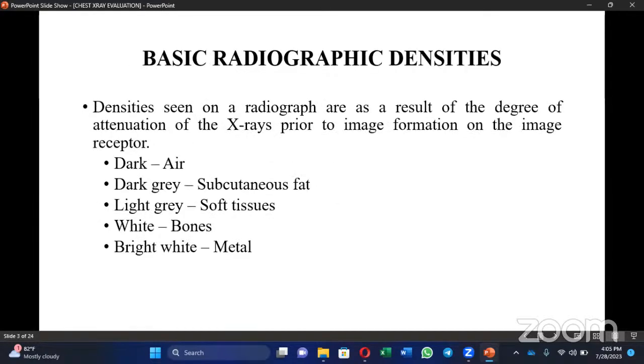Throughout this session, I'll be interchanging the words X-ray image and radiograph. Actually, radiograph is the right word to say because radiographs are the resultant images that are produced and printed on X-ray films, or, in the digital world, the X-ray images that we see on our screens. Those are the radiographs. I think that is the right word to use for X-ray images.